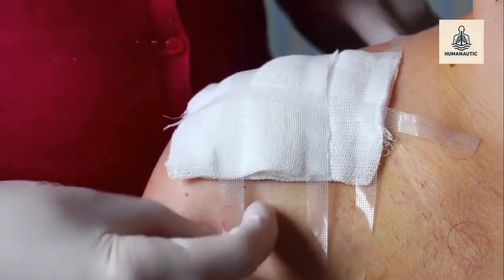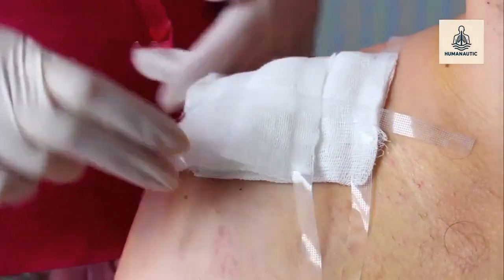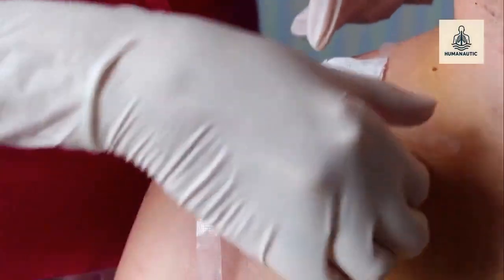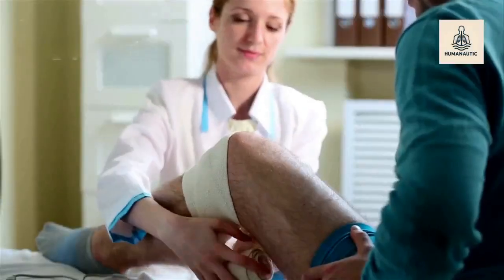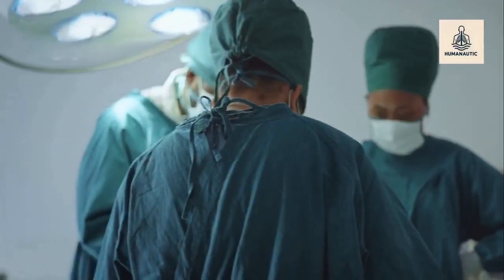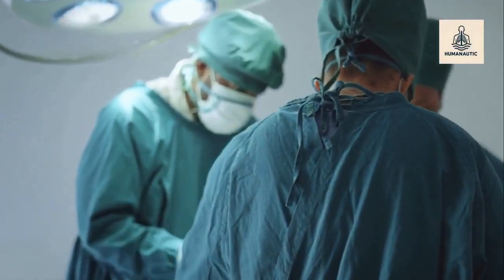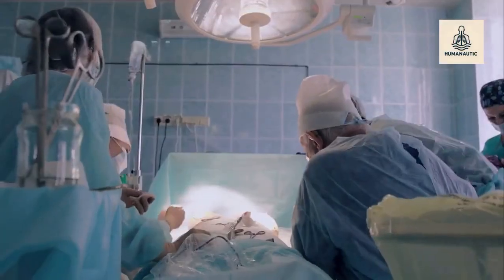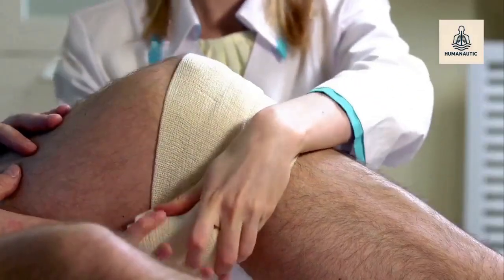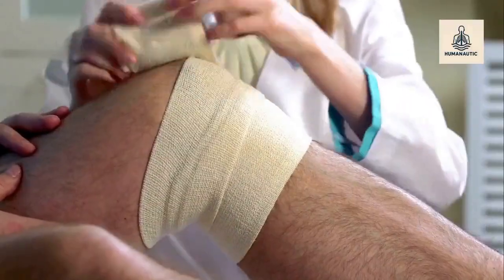Wound debridement is the removal of dead, devitalized, infected, or contaminated tissue from a wound to promote proper healing. Dead tissue delays healing, encourages bacterial growth, and increases the risk of infection and sepsis. A wound cannot heal unless non-viable tissue is removed.